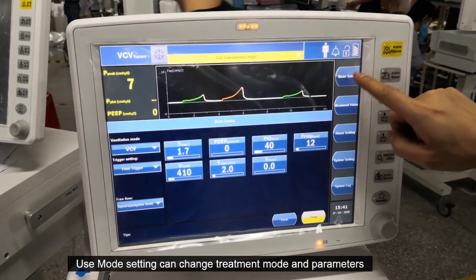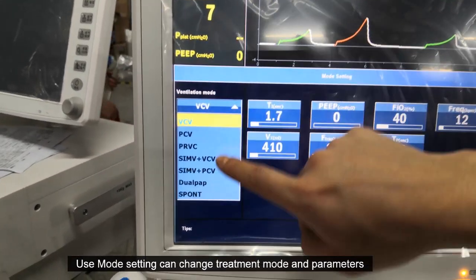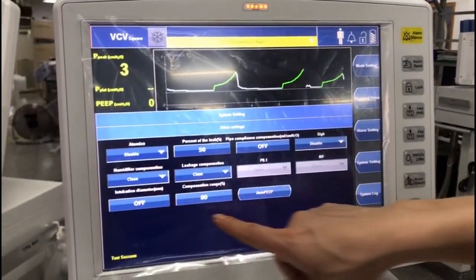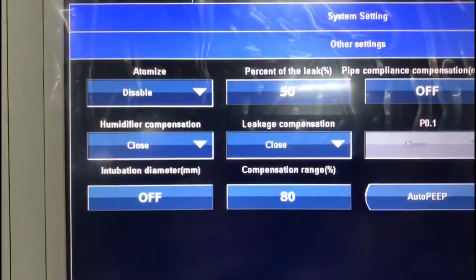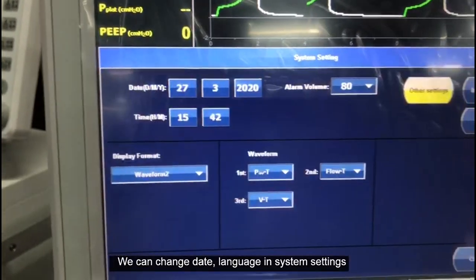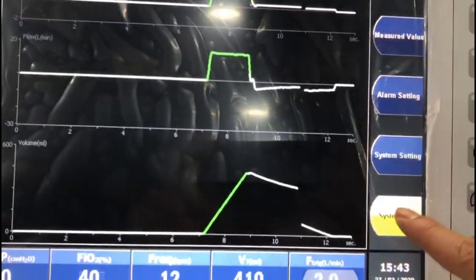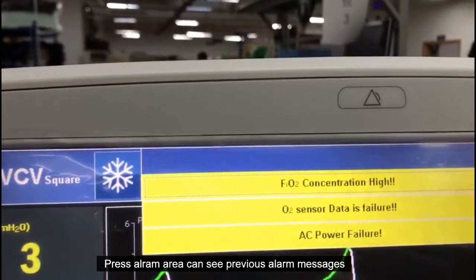Use mode settings to change the treatment mode and parameters. We can change the date and language in system settings. Press the alarm area to see previous alarm messages.